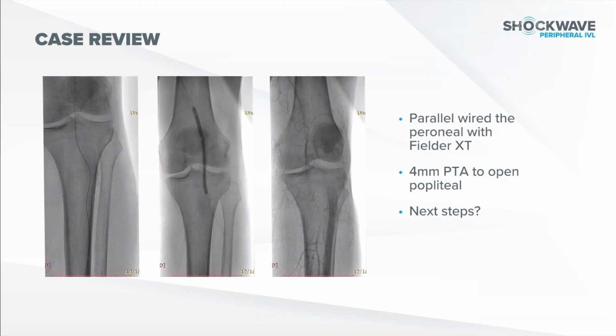We did a little bit of angioplasty just to get some luminal flow. And you can see still here, we were undersized with that balloon angioplasty, 4 millimeters. Really not much flow across the popliteal, and a little trickle flow now into that peroneal artery. So what did we do next? We saw the calcium. We had sized appropriately. We were thinking that we're going to need a stent.